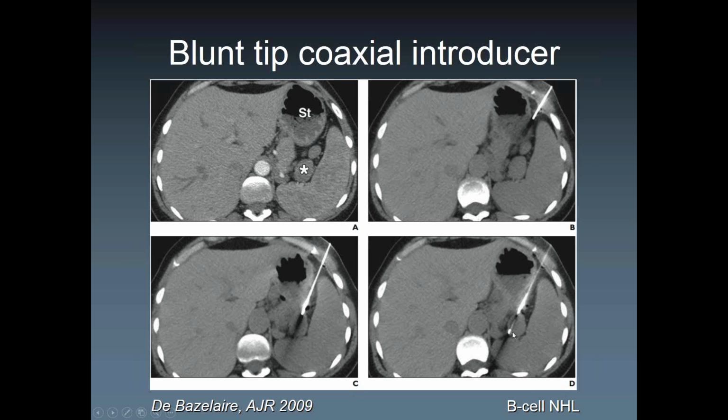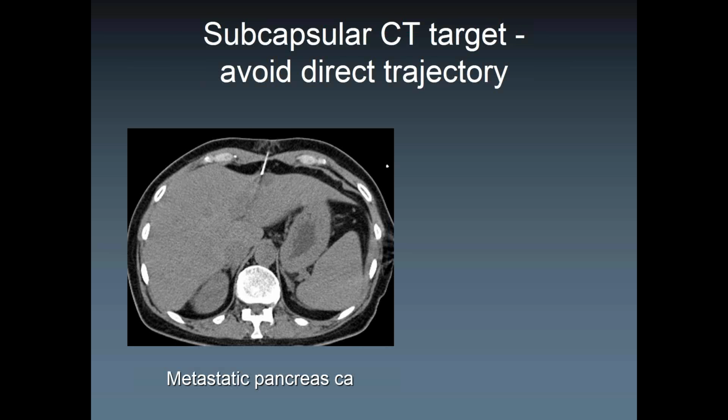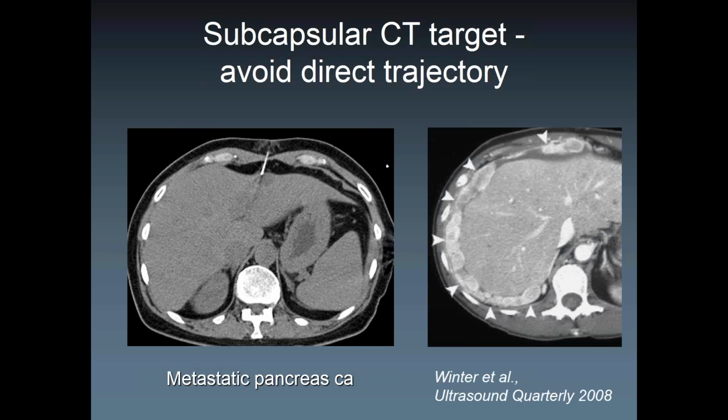But if you cause seeding in the peritoneal cavity, you not only upstage the patient, let's say it's an HCC because it wasn't outside the liver before, but you can make the patient's life miserable by causing malignant ascites, and we've seen that too, right? So be sure you don't do that. That's obviously a CT image from an outside facility, of course. Don't do that, but if you try to, this is what can happen, right?